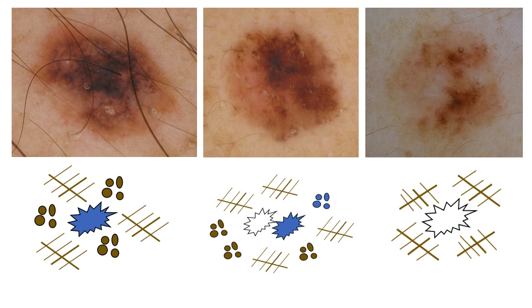The sclerosing nevus on the left is characterized by a combination of patterns — clods, lines reticular, and structureless — with brown and blue color. The lesion in the center is characterized by clods, usually brown and a few in blue color, structureless areas both blue and white, and brown lines and network. The lesion on the right is characterized by white structureless areas and brown network.